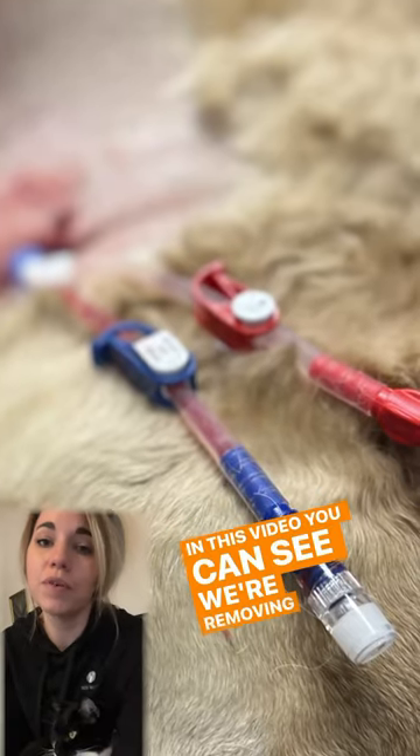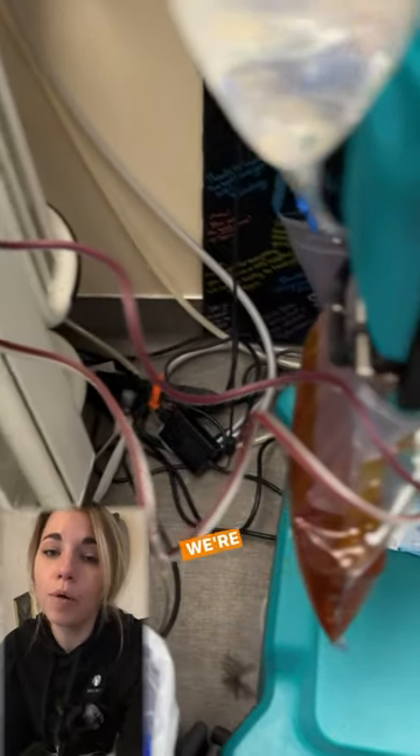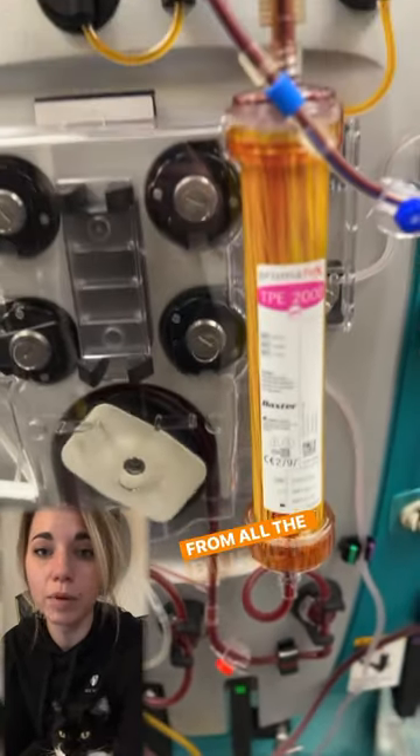In this video you can see we're removing the blood from one port of her dialysis catheter, which is sitting at about the level of her right atria. We're passing it through the system past the blood pump into the filter. The filter removes the plasma, which in this case is yellow from all the bilirubin.